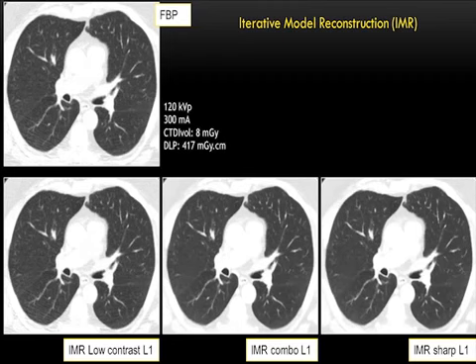If you look at the posterior part of the lung bases, there are streak artifacts caused by the vertebral body. With this setting, probably it's not disappearing, but over here, they're significantly reduced. So the key message here, again, is that it's important to pick the right setting of IR for the desired effect which we want in the image quality.